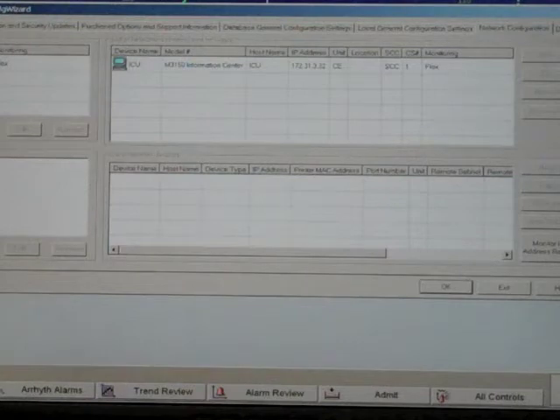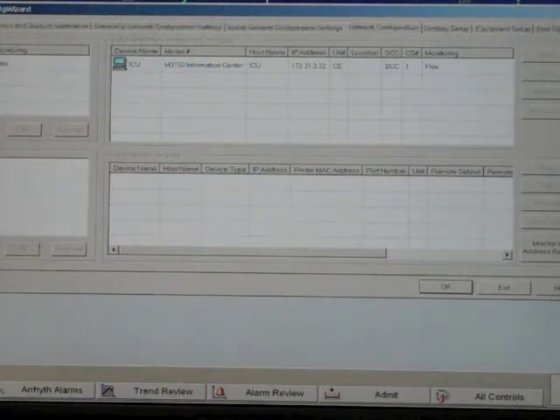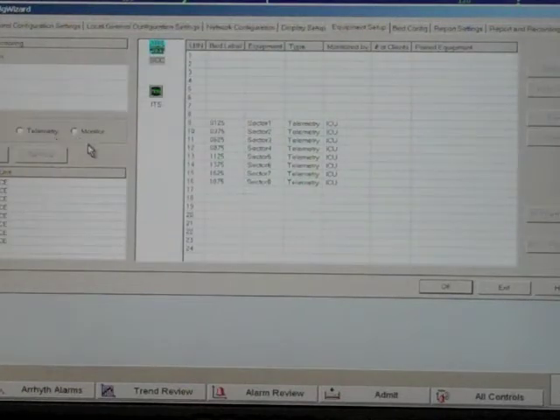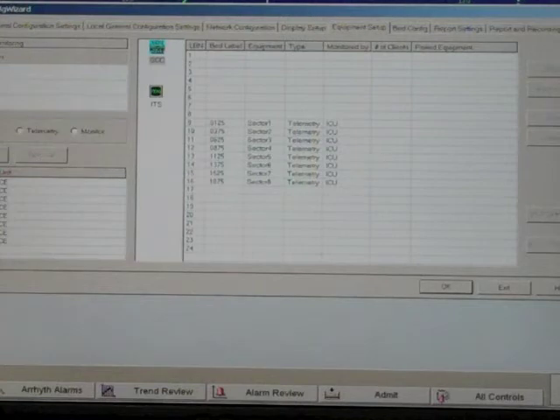The next tab to click is the equipment setup tab. If the settings are wrong in this tab, your system will not function. The first thing you want to verify is that the unit is set to flex, the same as it was in the network configuration tab.